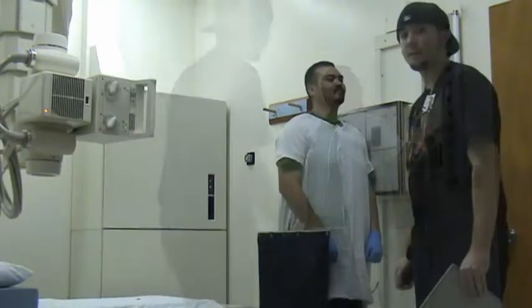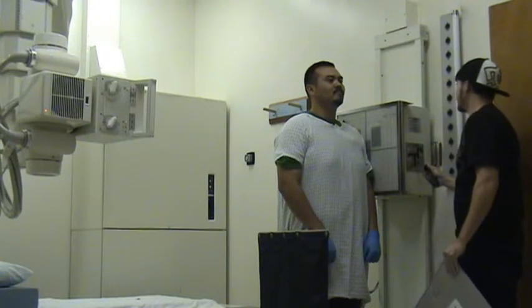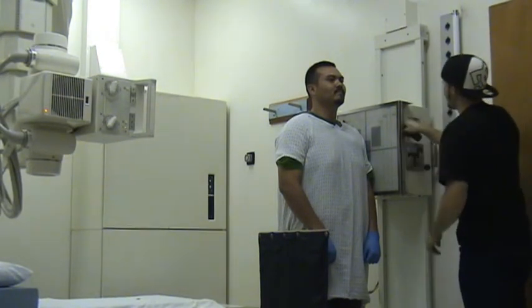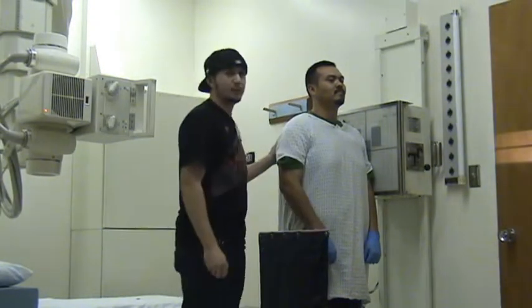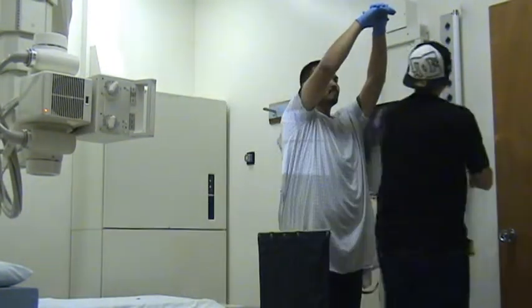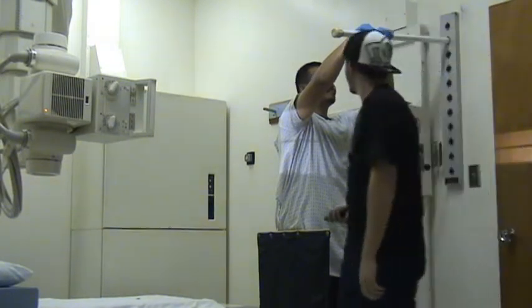We're going to set up here for a lateral chest view. What we're going to do is put this according to portrait, this marker side on top of the cassette. And we're going to tell the patient to go ahead and lift up their arms, so we get a feel here. If they're unable to lift up their arms, you can always tell them to hold on to this pole here if your department has one.